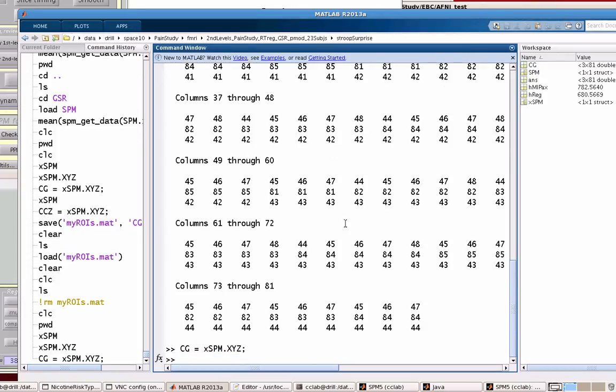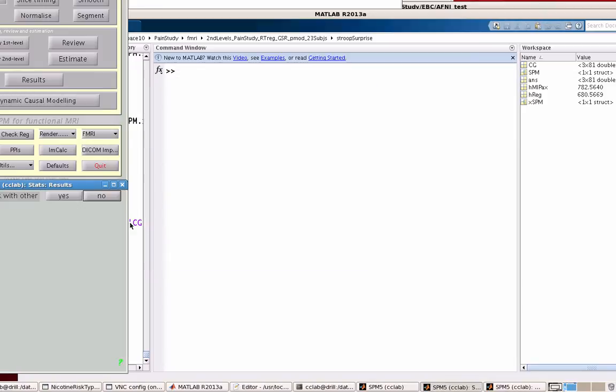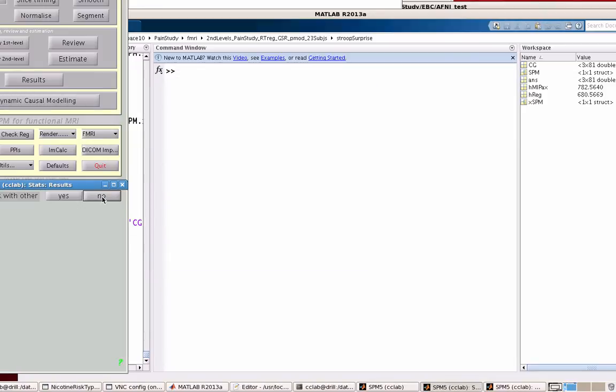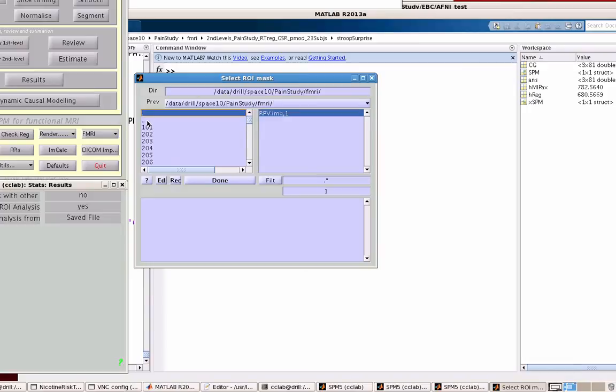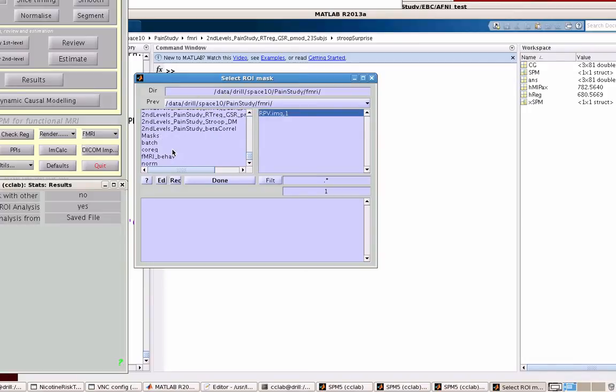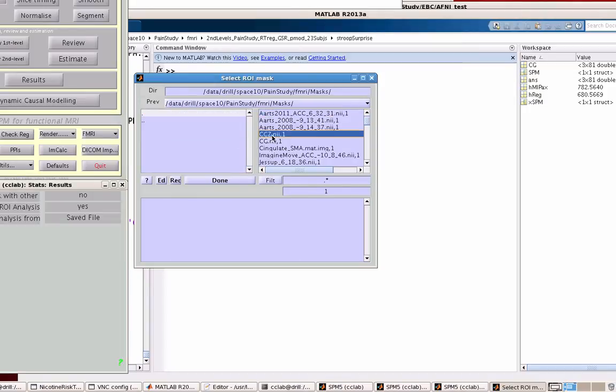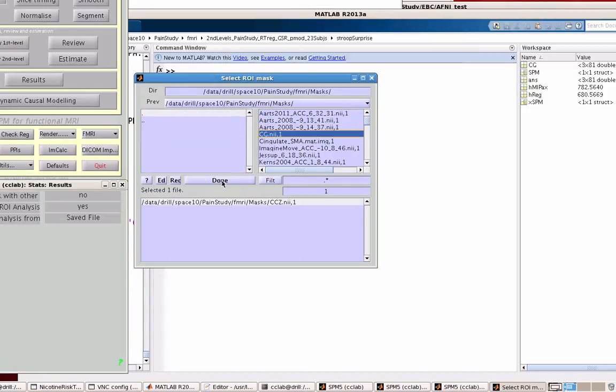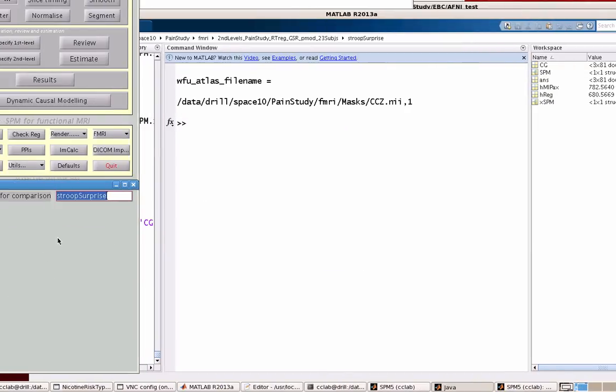Now I can go back to the results, load up an arbitrary contrast. It doesn't really matter too much. I'm just using this to get coordinates for right now. It could be any contrast because if we set it to 1, a p-value of 1, everything is going to be active in that ROI.